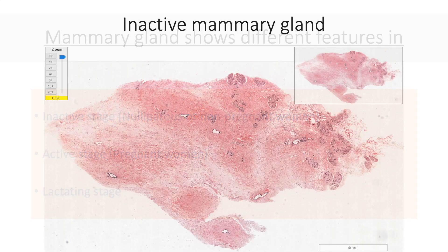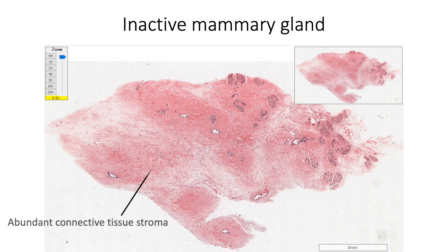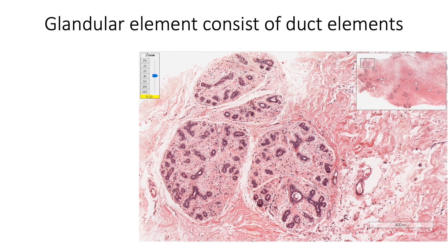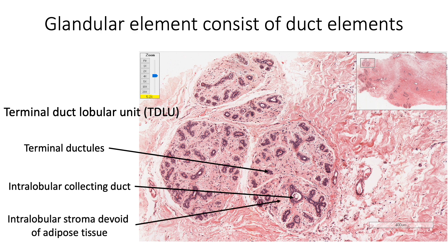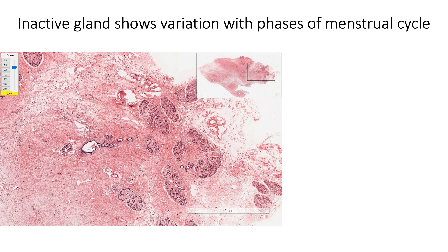The inactive mammary gland has abundant connective tissue stroma but sparse glandular parenchyma. The glandular element consists mainly of duct elements. The functional terminal duct lobular unit shows presence of terminal duct tubules, intralobular collecting duct, and sparse intralobular stroma which is devoid of adipose tissue. This inactive gland shows variation with phases of the menstrual cycle.